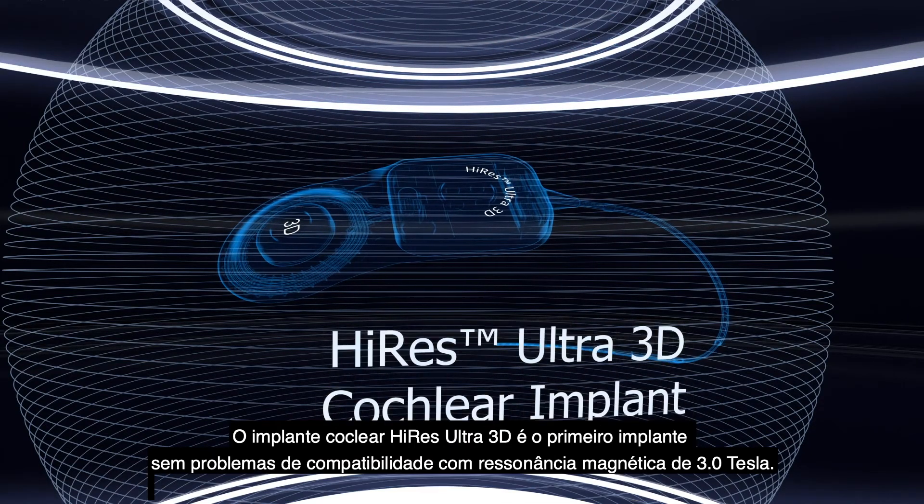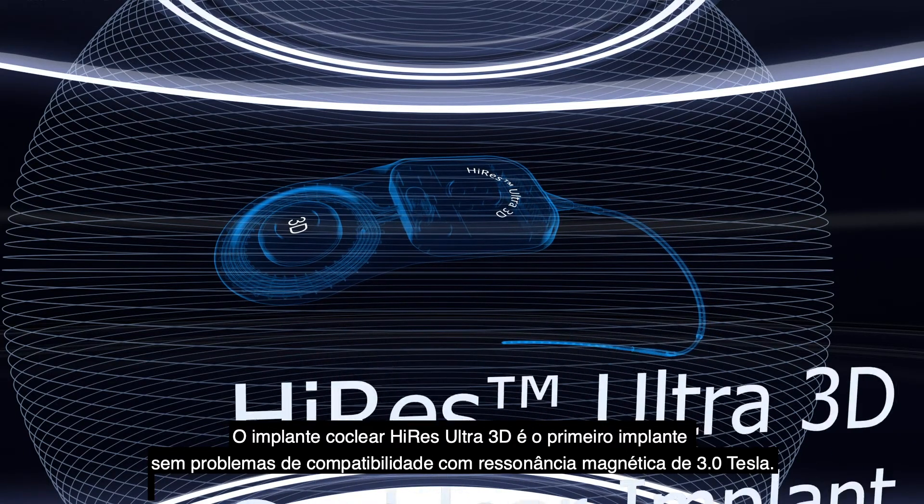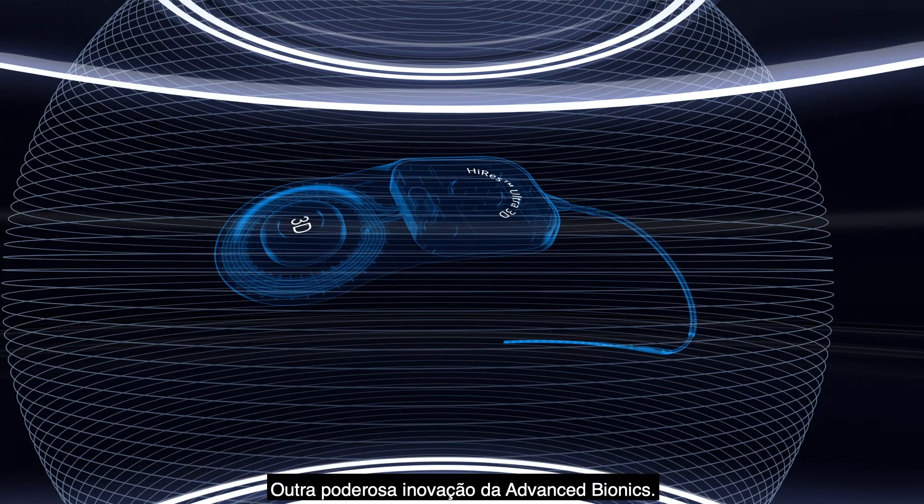Hi-Res Ultra 3D Cochlear Implant is the first hassle-free implant compatible with 3 Tesla MRI. Another powerful innovation from Advanced Bionics.